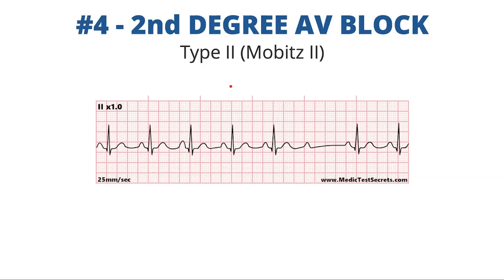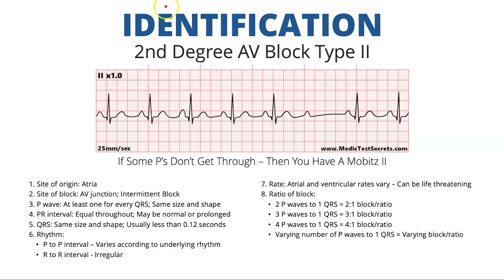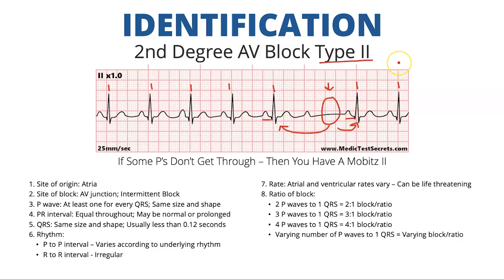Next we have second degree AV block type two, or Mobitz two. For this rhythm we again have an irregular R to R interval. I can see where the beat should land — and we have a dropped beat. I'm going to look at the QRS after and the QRS before, and look at the PR intervals. The PR intervals are the same — because the PR intervals are the same, I know that this is going to be a type two AV block.